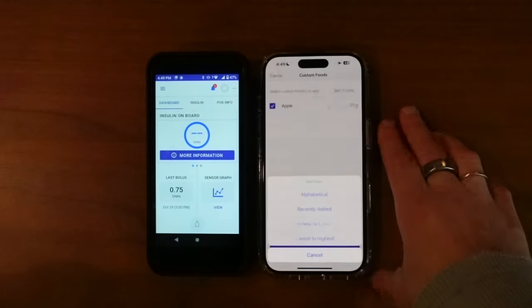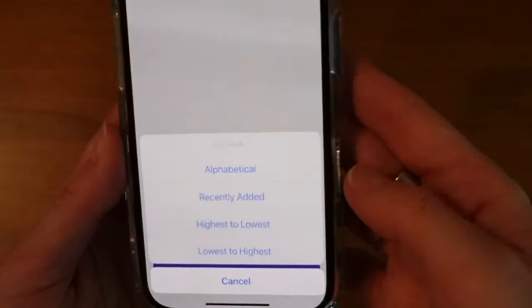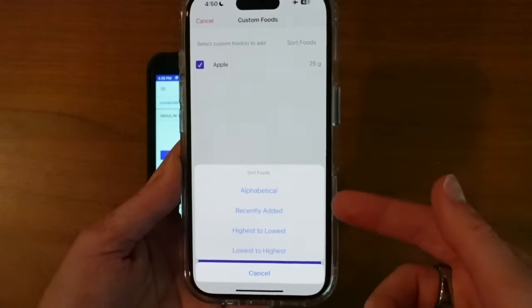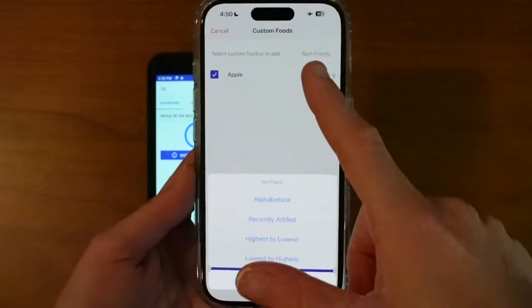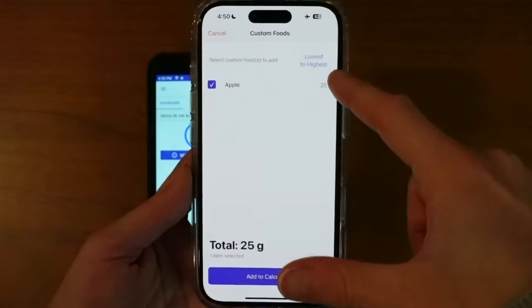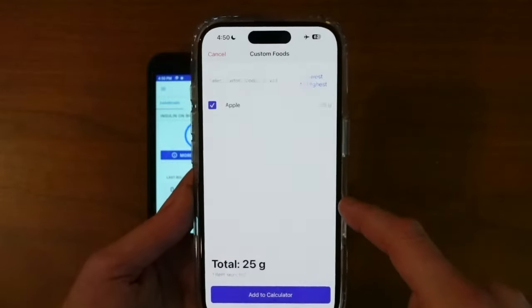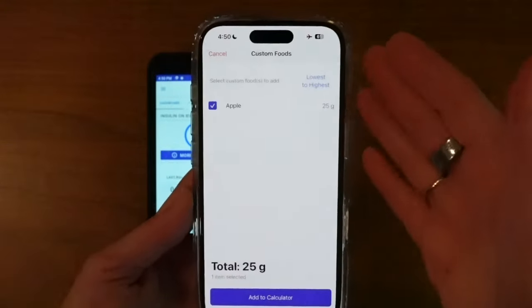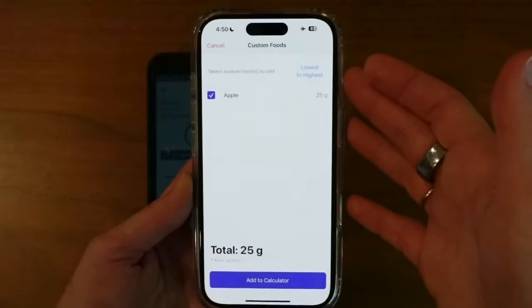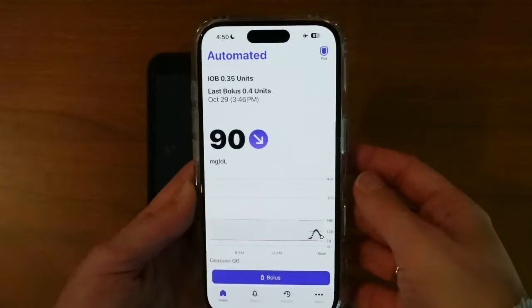I see 'sort foods' up here — alphabetical, recently added, high to low, low to high. Interesting. Even think if you were like, I want a lower carb snack, and you had all the foods you ever ate in here, you could sort lowest to highest and say, these are the lowest carb snacks, I'm going to opt for one of those. This could even become a bit of a Bible in terms of food options. That is a neat feature.